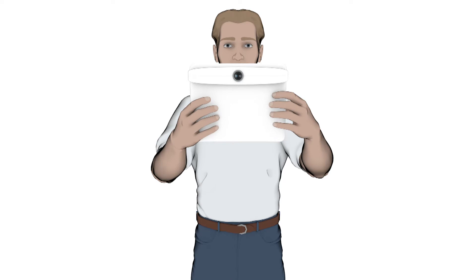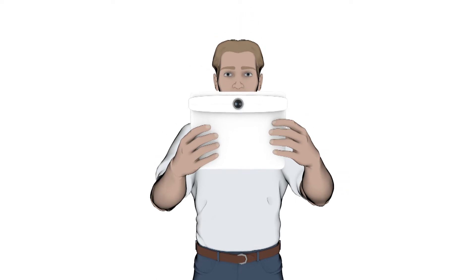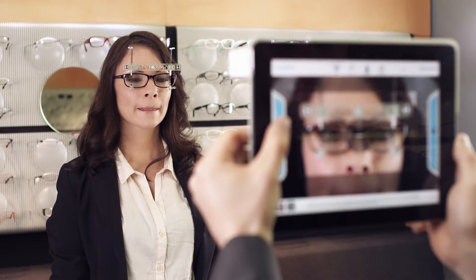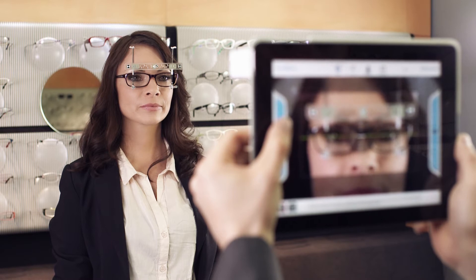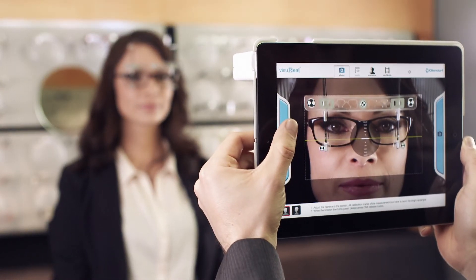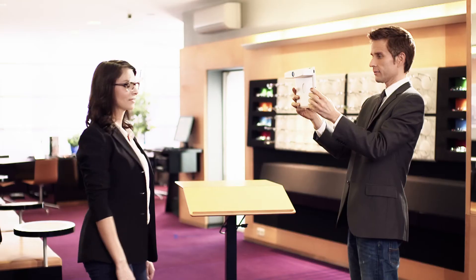Ask the patient to look at you directly and to fixate the objective lens during the recording. Take the front view picture. For this, all calibration marks of the measurement tool have to be in the bright rectangle and the horizon line has to be green.